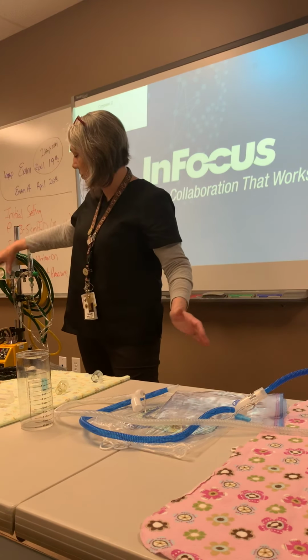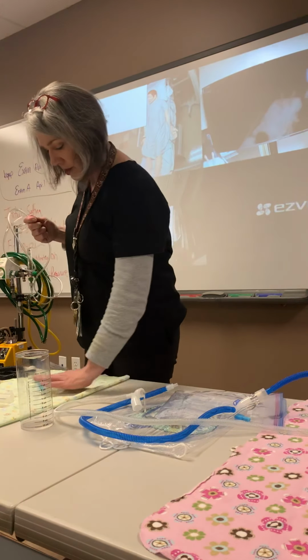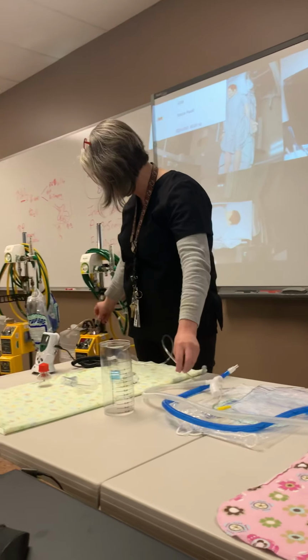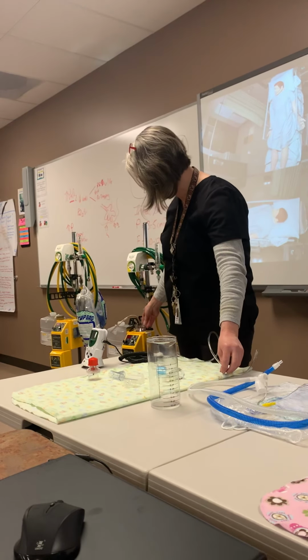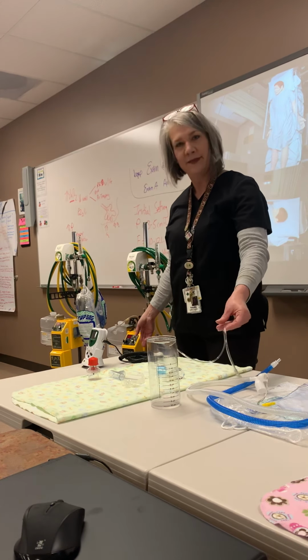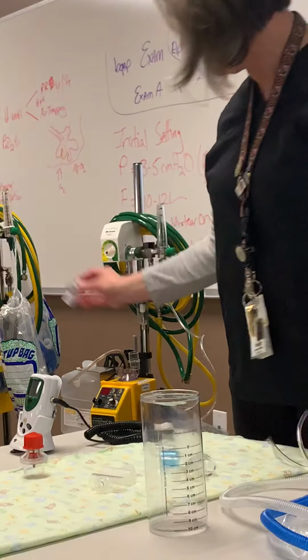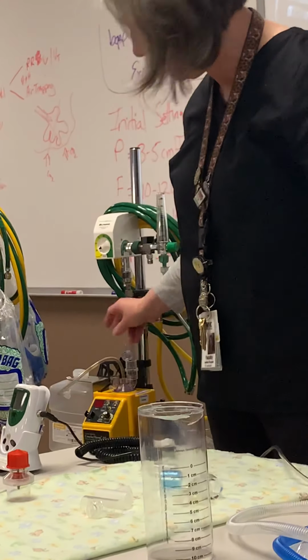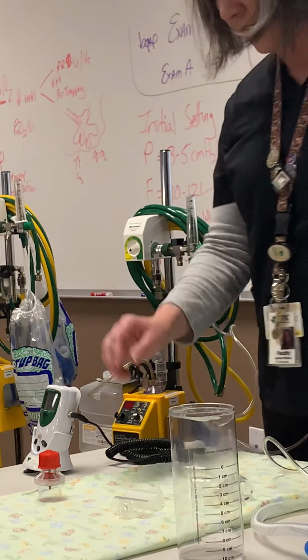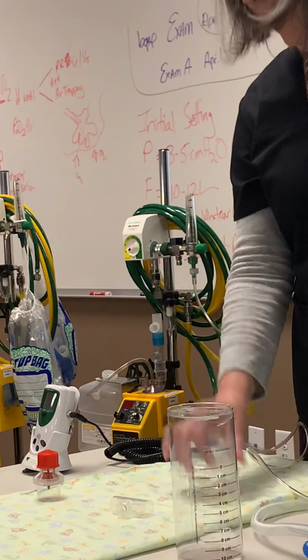So, stand, stick pole, you've got the flow meter, you're going to connect your O2 tubing. I'm going to put this together for you. So 22 millimeter on the bottom of your concha, all right? So 22 on the bottom, a T piece on top of that. On top of that, another 22. On top of that, another T piece. And then on top of that, your nipple adapter.